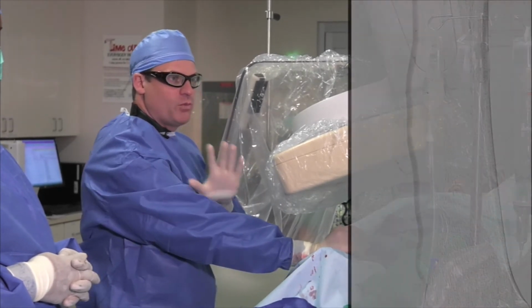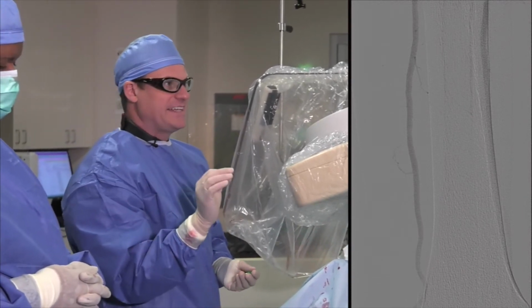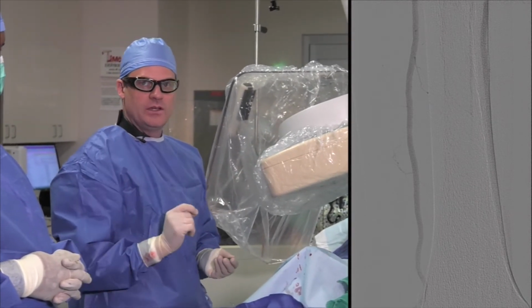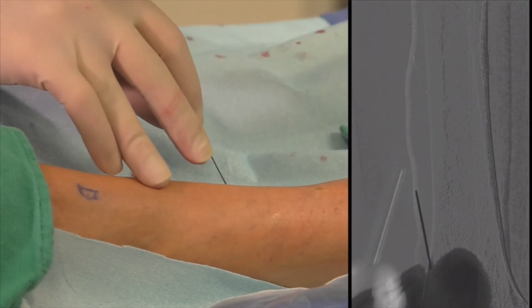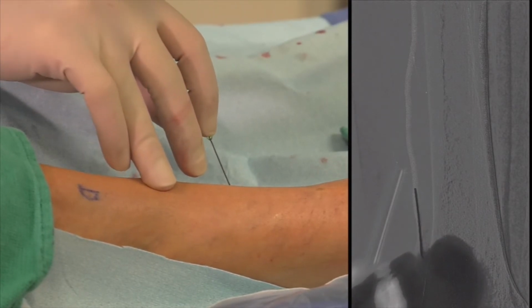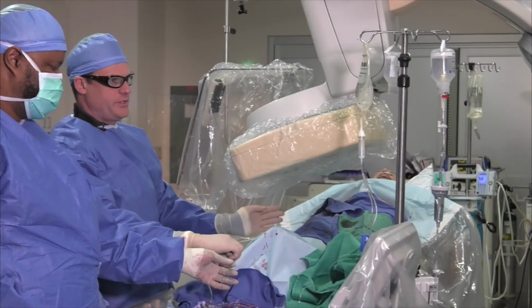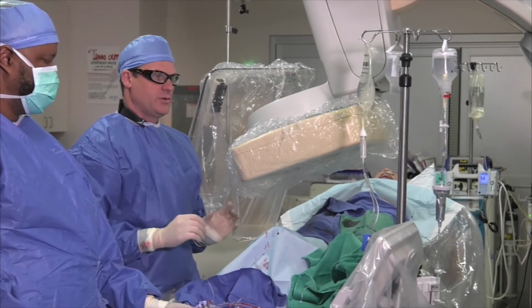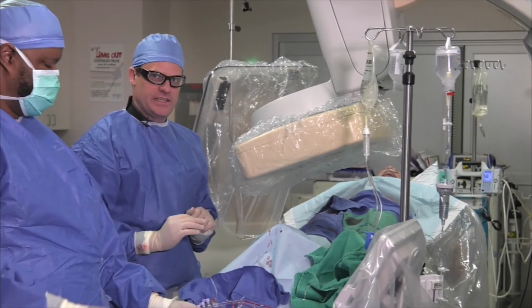It's so important. As you're watching it angiographically, what we've done is we've taken a fluoro-subtracted still image of the shot, and we place it up there, and we're going to watch it real time as the needle goes through the vessel. Okay? So let's do this. Sometimes you can feel it pop, and usually I have someone watching as I do it to see when I get blood flow. So we've got good blood flow, as you can see. It took a matter of maybe 5 seconds to access. So if you're comparing angiographic access to ultrasound access, it's just as quick. You just have to use these techniques.